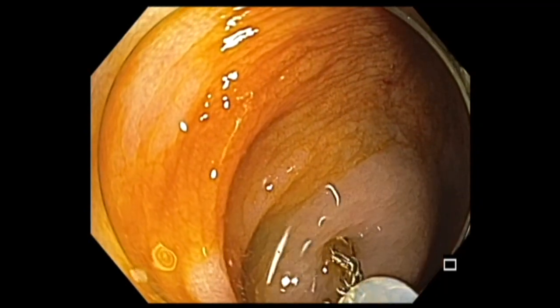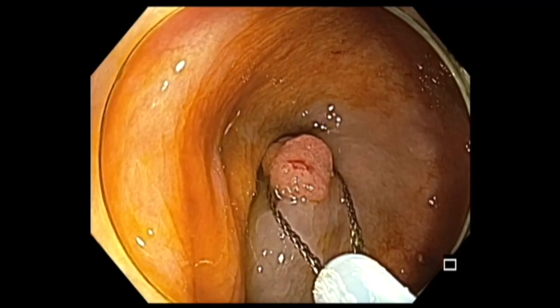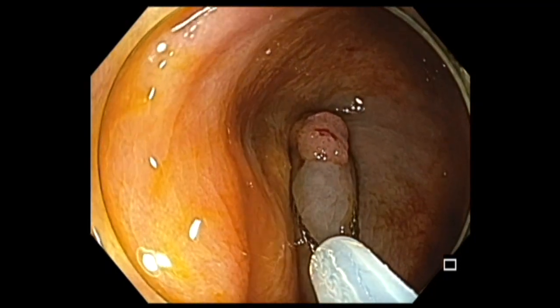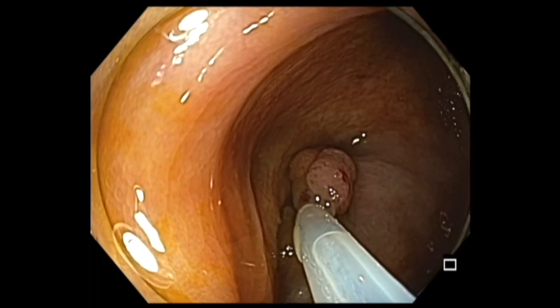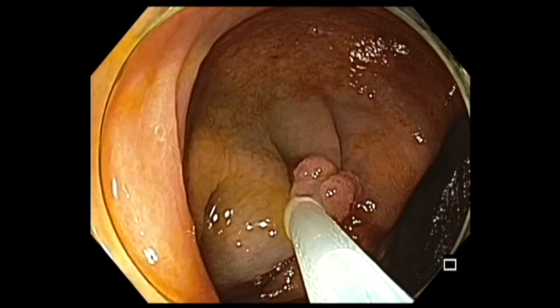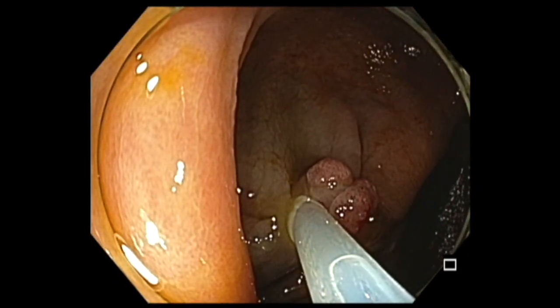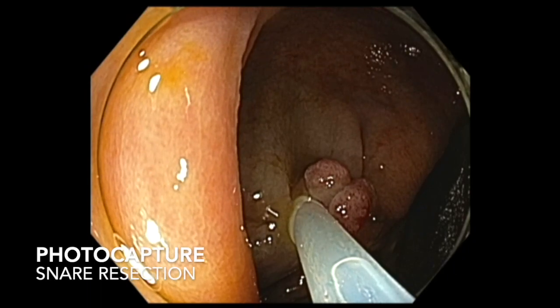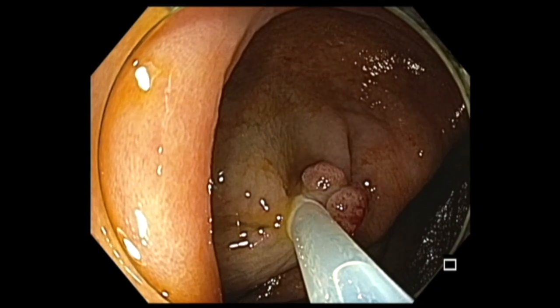And then I used a hot snare to resect. Here is the hot snare going around the polyp. I try to document my snare placement around the polyp as well. You can see I have taken another picture prior to snare resection.